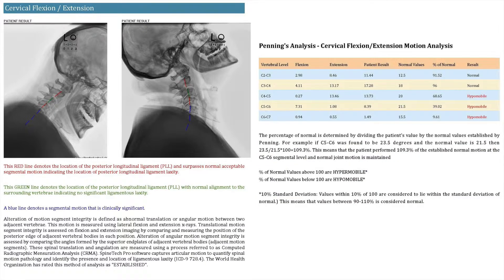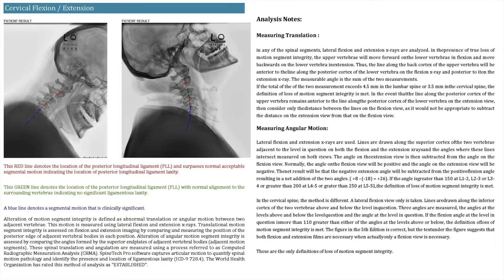The software also does Pennings analysis. You're going to get a Pennings analysis showing whether the joint is normal, hyper, or hypomobile. Here are the readings in the normal column and the ratings of this particular patient.